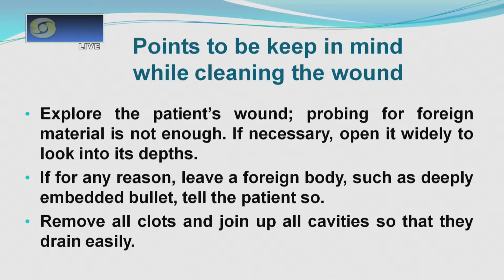So you have to be very gentle, and you expose the patient's wound and probe for the foreign material, all of which is foreign to that wound. So you have to explore and remove all this foreign material. If necessary, open it widely to look into its depth.